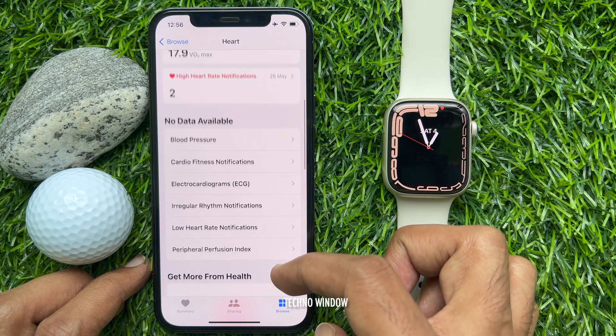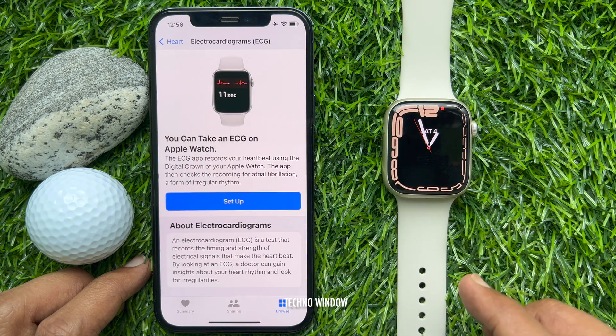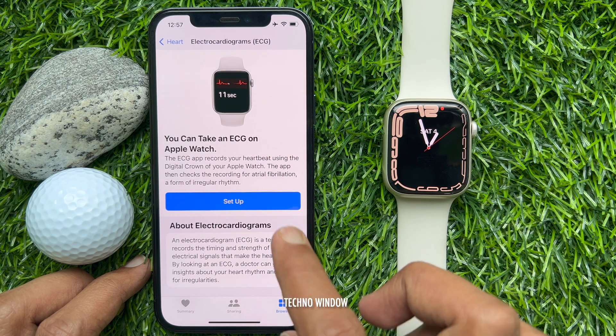Scroll down a little bit and tap Electrocardiograms ECG. You can take an ECG on Apple Watch. Tap Setup.